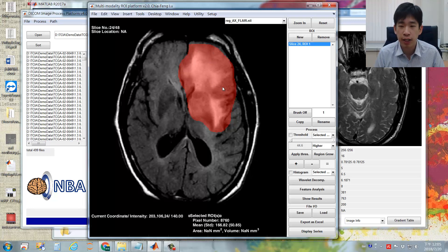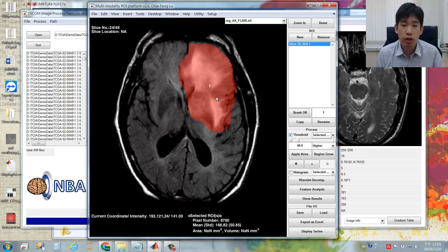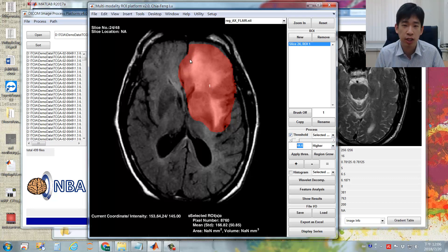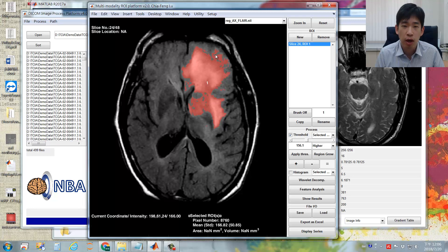You can modify this ROI by clicking the threshold checkbox within the process panel. A pop-up menu appears, and you can select the targeted ROI. The function of thresholding helps you get rid of pixels with lower or higher intensity that you don't want. Select the criteria to be 'higher' — pixels higher than the specified value will be included in this ROI. You can adjust this value by typing a specific number or using the slider bar. This is useful for lesions with very complicated ROI boundaries.